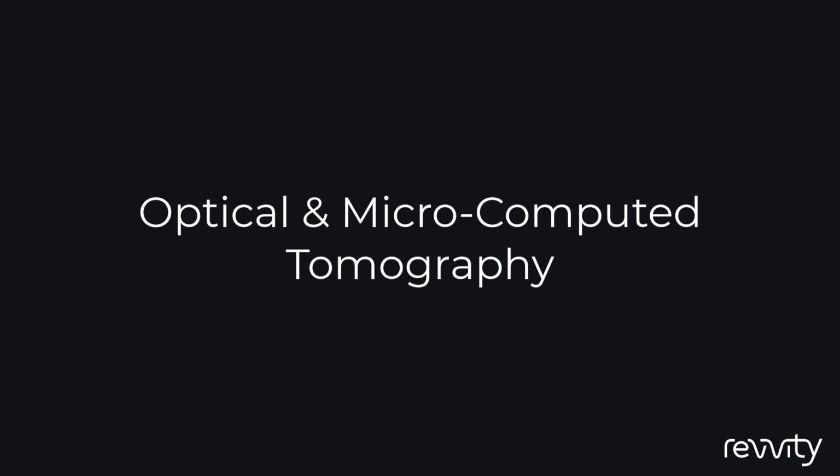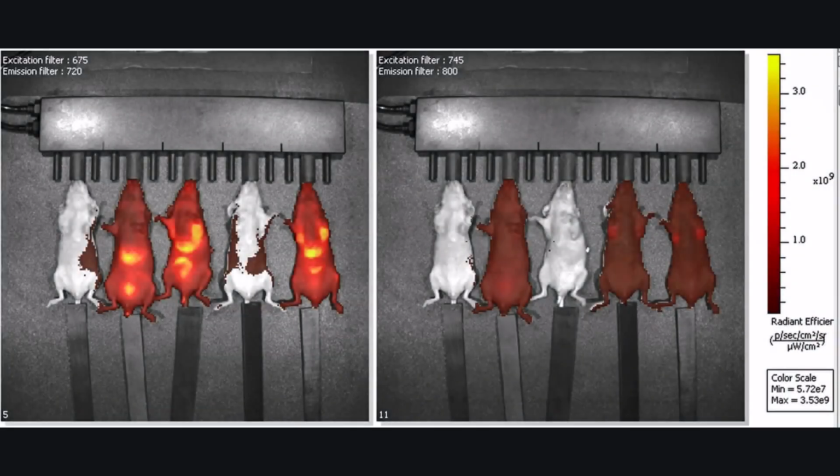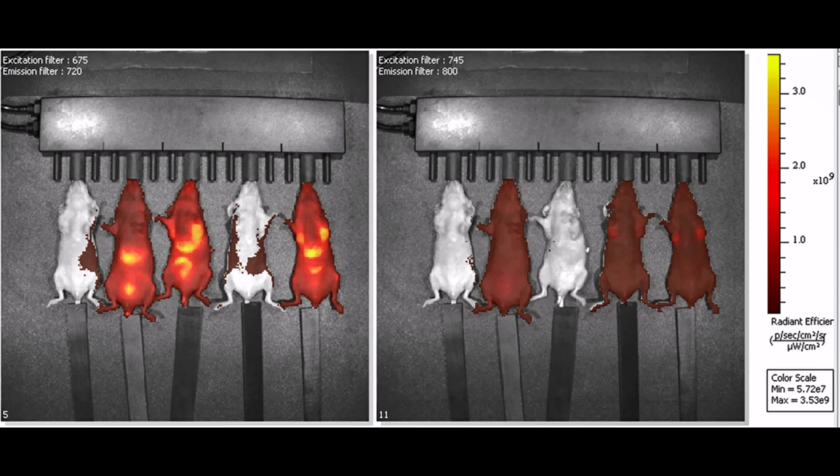Our previous videos demonstrated procedures for imaging bioluminescent and fluorescent sources in vivo in 2 dimensions. With these methodologies, we collect the light that reaches the surface of the animal from various locations within the body and calculate cumulative surface intensity. Although 2D imaging is highly useful for tracking intensity as a function of time within a region, particularly in response to a stimulus or treatment, we cannot discern the absolute amount of signal because tissue attenuation is not accounted for.